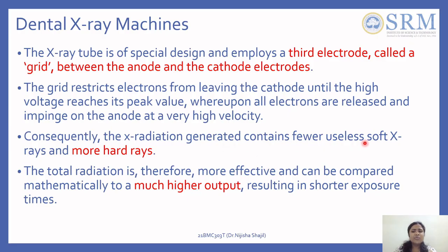So it contains fewer useless soft X-rays and more hard X-rays. So what happens because of that? It is more effective and it can be compared mathematically to a much higher output, resulting in a short exposure time.